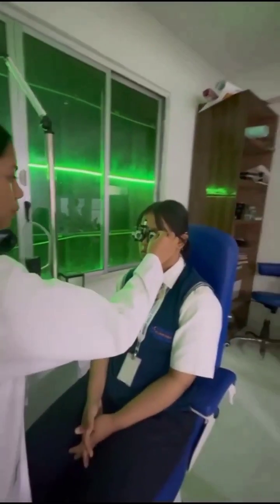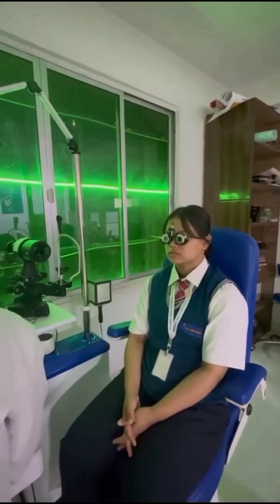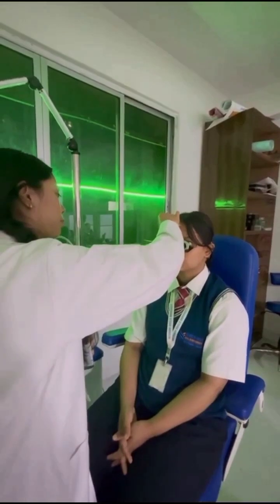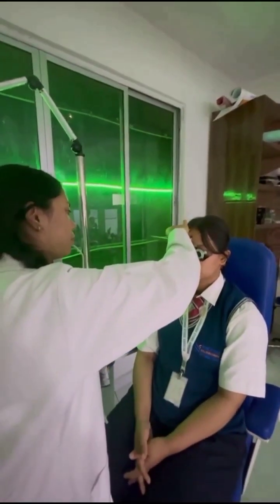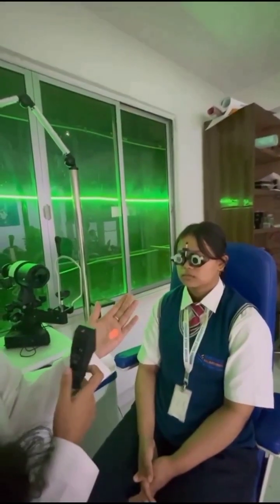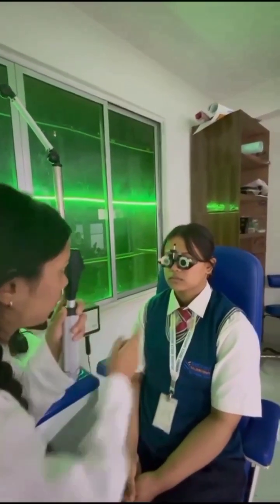Now I'll repeat these steps on her other eye. As you can see, this is the block or the occluder. I am putting this occluder on her neutralized eye, and also I am putting this spherical lens to neutralize the spherical power. Now I'm projecting the light on her eye.